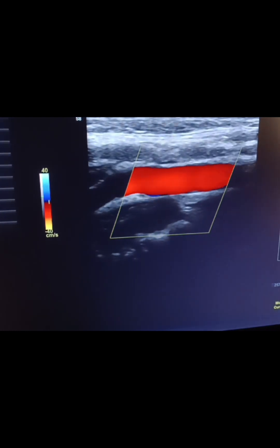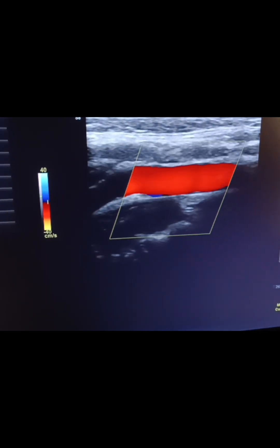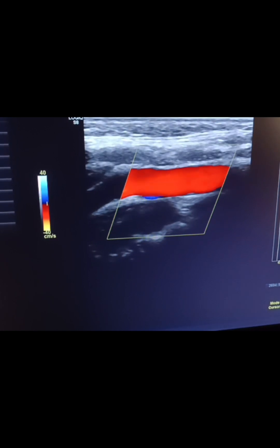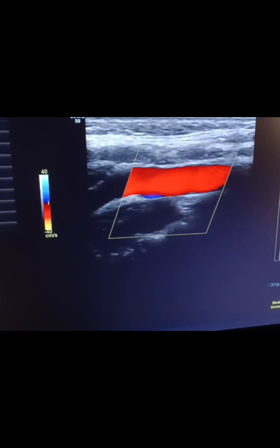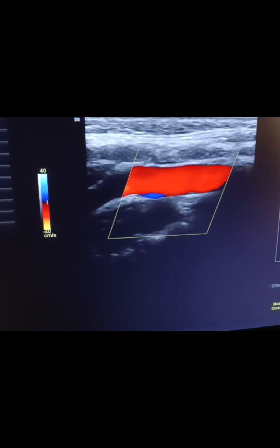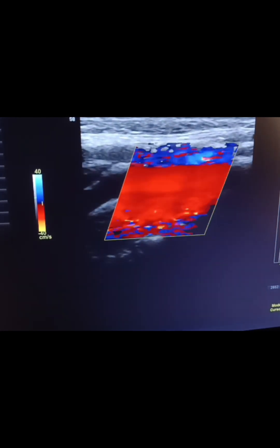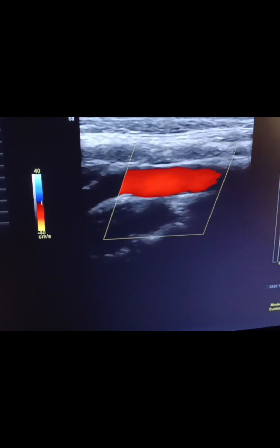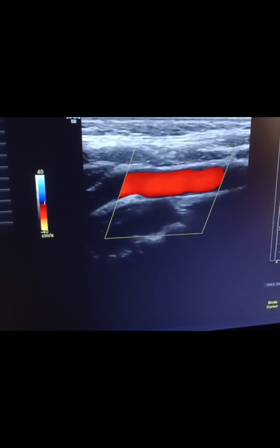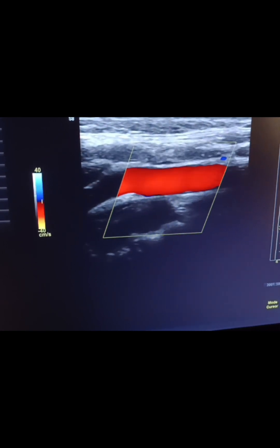I want you to understand the terms I'm using. You're going to hear color gain, color scale, PW gain, PW scale — they're all different terms. So in this case, we're talking about the color gain. High color gain — not good. Low color gain — not good. You want to optimize it just well enough to fill up the box. That looks good.